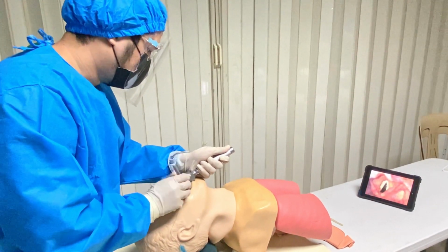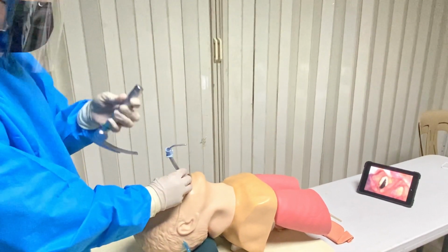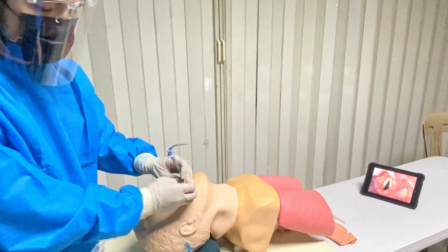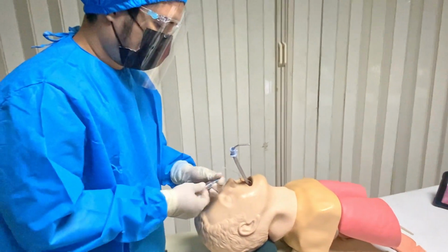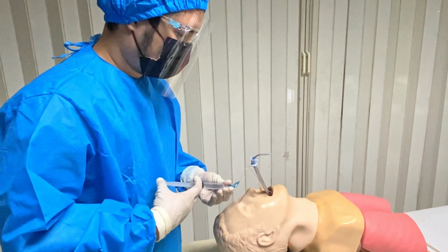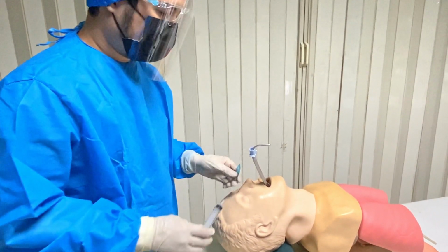Advance the tube further by increments of 2 cm until the cuff is about 3 to 4 cm beyond the vocal cord. Handle the tube with a pencil grip. The tube should be about 20 to 22 cm in. Once in position, remove the laryngoscope. Inflate the balloon with a 10 cc syringe to secure the tube within the trachea.